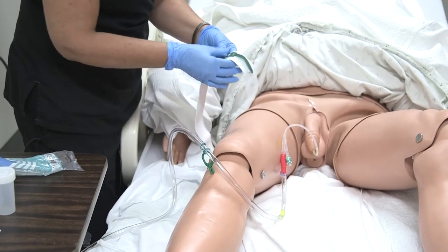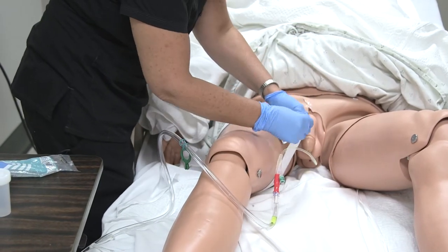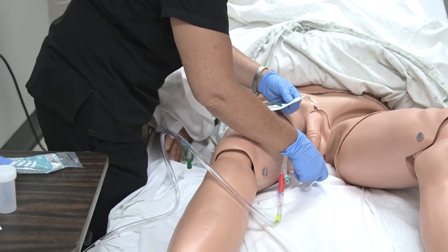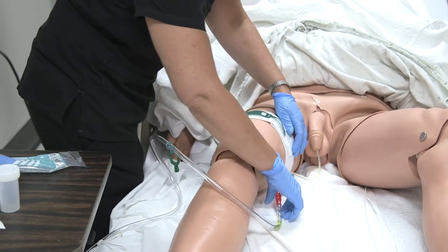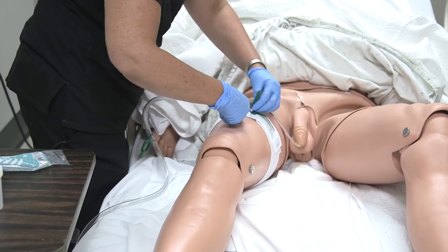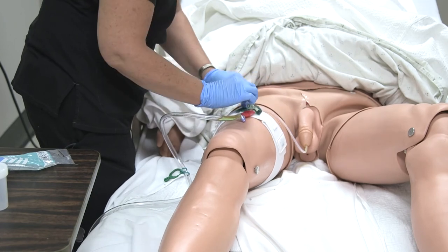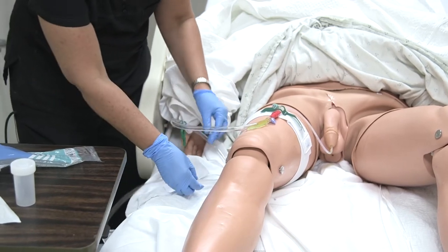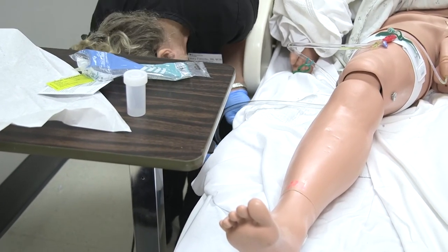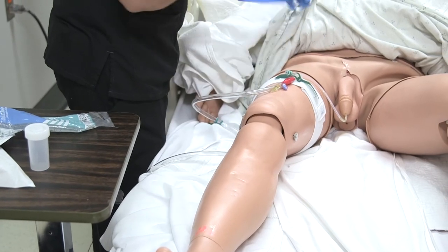So this is a primitive type of fastener. So Tim, I'm just going to go around your leg with this, and it's Velcro. I think I have to go like this with this one. So with these, you want to make sure the little port here goes through there, and then that's attached on there. And then this tubing is draped over here, and you want to put your bag on the bed frame. Don't ever put it on the rail, because rails go up and down. All right, Tim, we are all done with this.